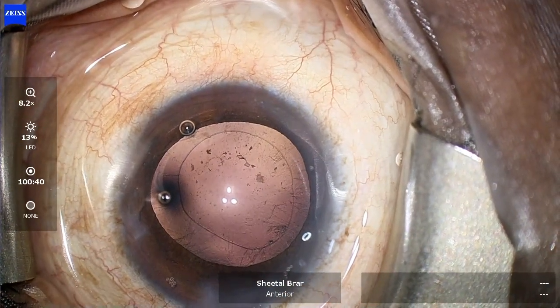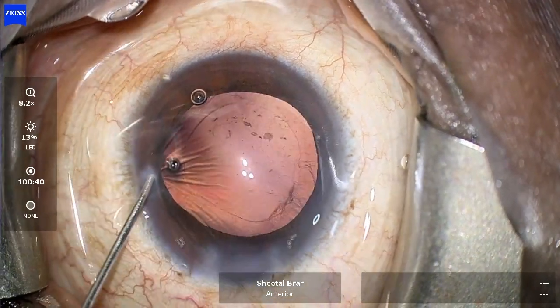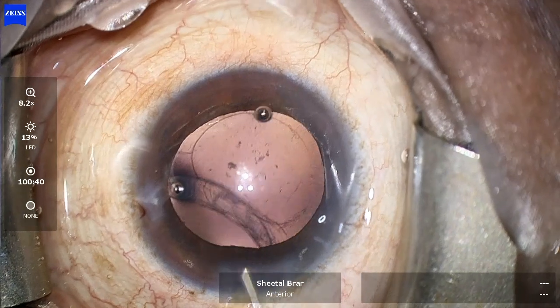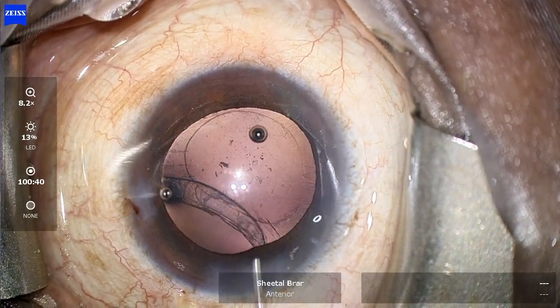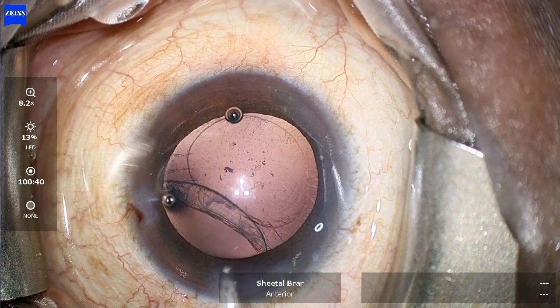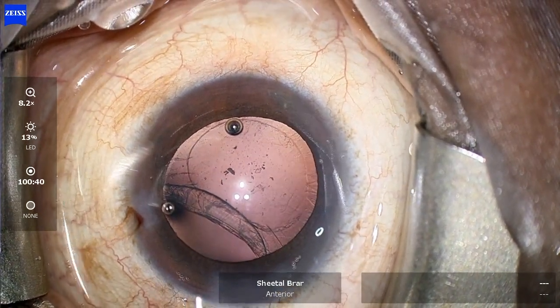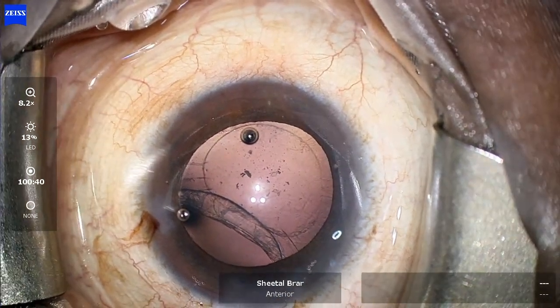I notice a slight change in the shape of my rhexis, which seems to have become a little oval. As I inject some fluid into the anterior chamber — oh my god — I see there is a zonular dialysis of three clock hours staring at me, and I have to manage it now.